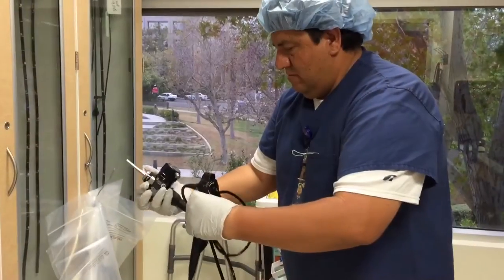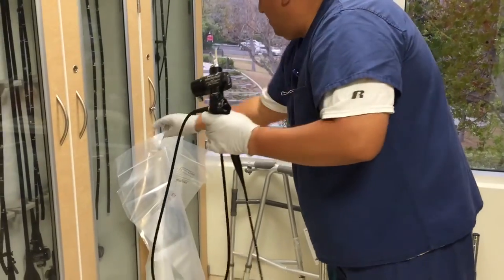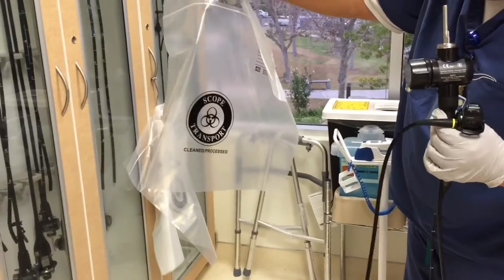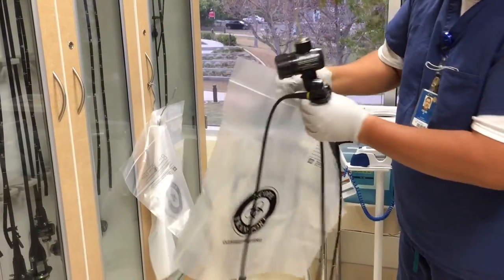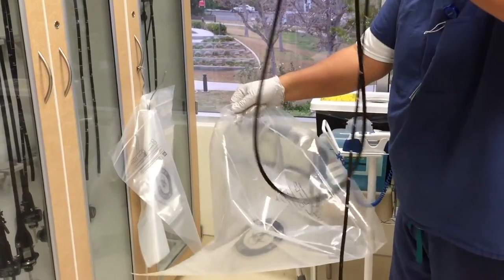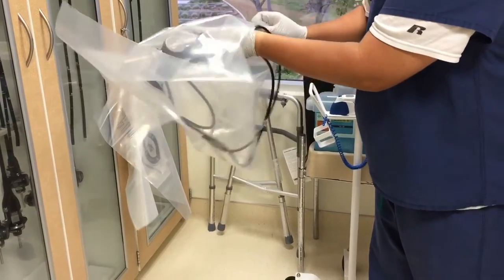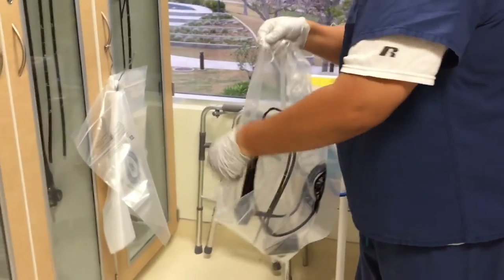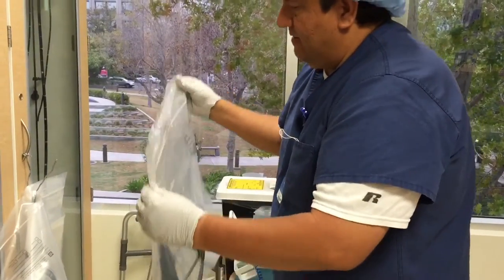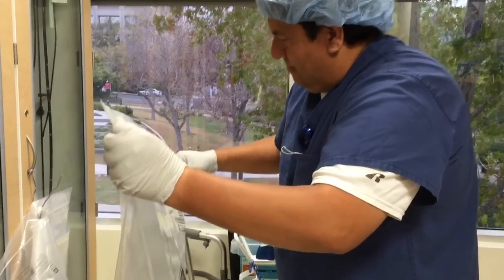So next door, he just transferred the scope. And to take it back to the bronchoscopy room, Oscar would put it in that plastic bag for transport. And that's it. The scope is ready to be used again.